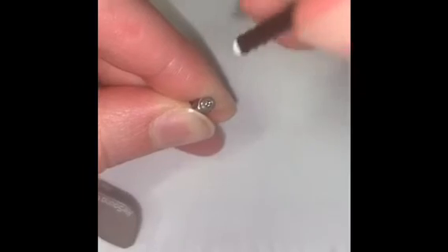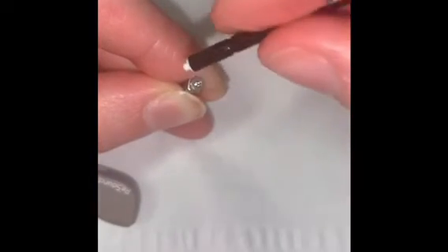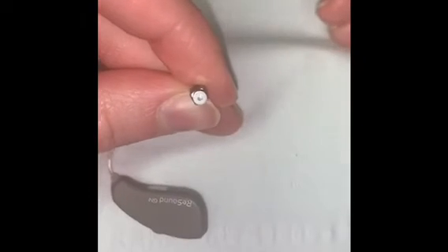You first start with the empty side and you place the empty side straight up and down into that white circle there and you pull, then flip to the clean side and replace — and that's how you change the filter.